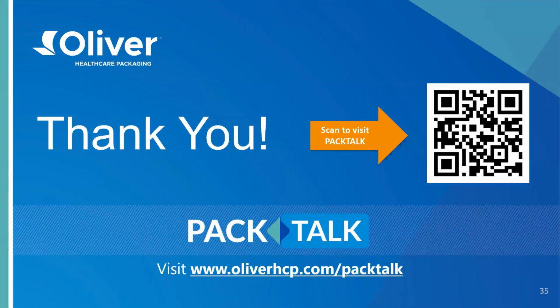That's a good question. I think that really depends on the level of tear and the type of tear that's occurred. Another question I'd have is, is it a double sterile barrier system? And if it is, in my opinion at least, anything inside that double sterile barrier system is sterile. So it is potentially possible to continue to use the device.